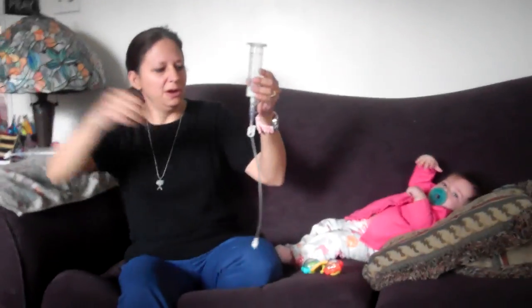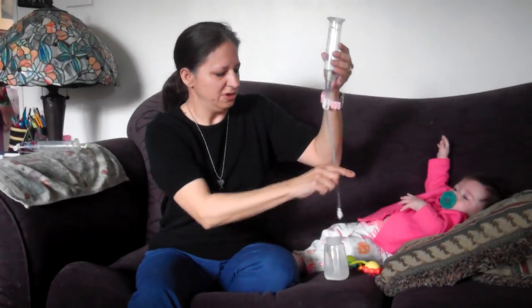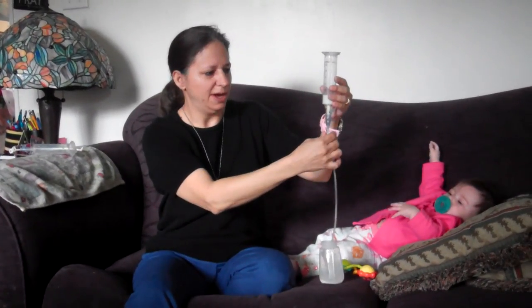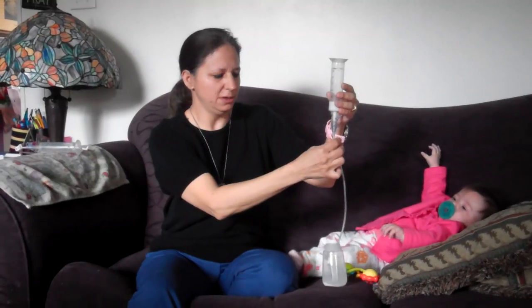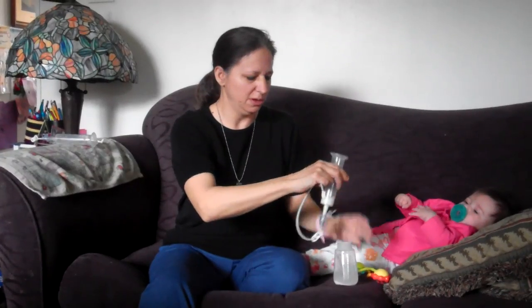So I'm just going to show you how you prime it. Put a little bit of your milk in there. And then you're just going to put it right back in the bottle and unclamp it, to get all the air out of the lines. Now there's no air in there because we don't really want to put any air in baby's tummy. Then you're ready to go. But this is just to show you.